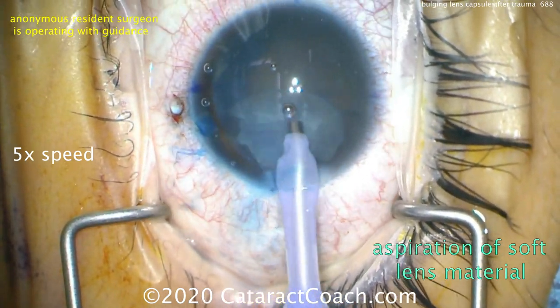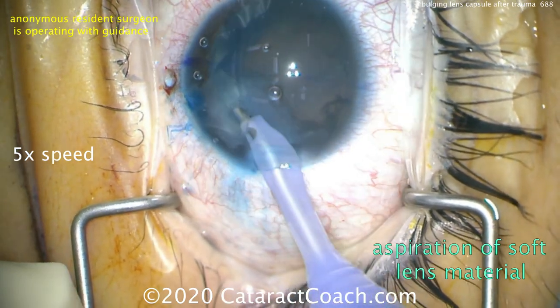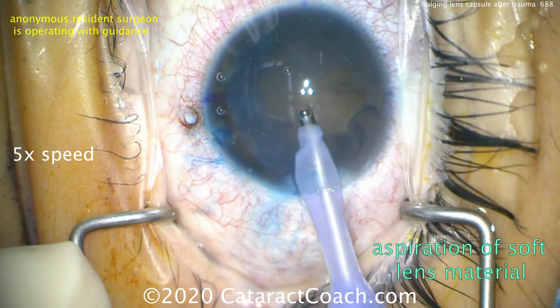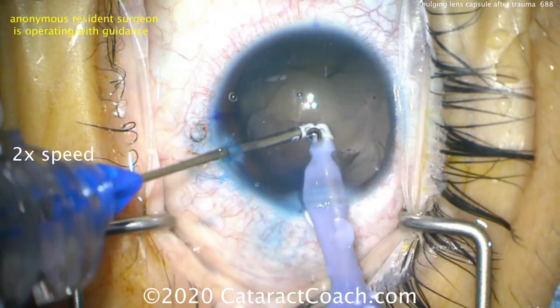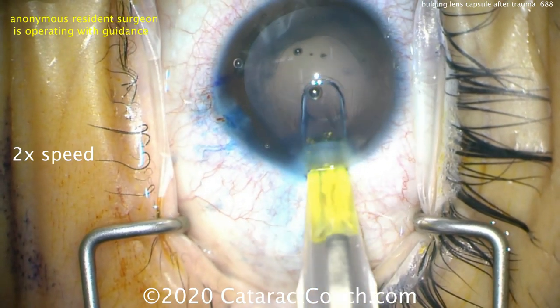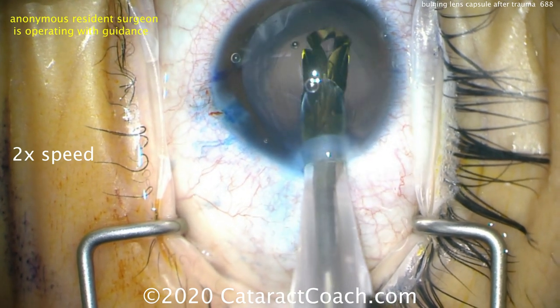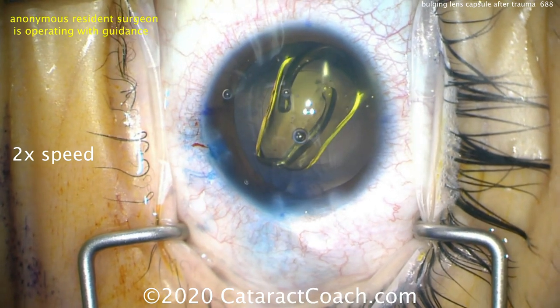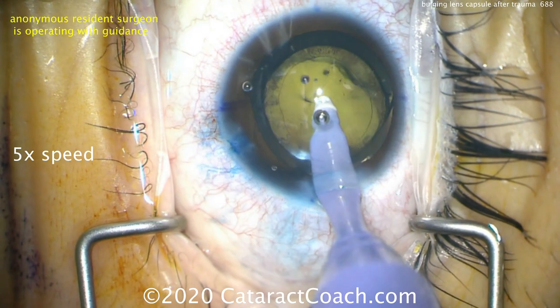The soft lens material is obviously very opaque and it's limiting his vision, and it's going to be removed quite easily. For the lens implant, we're going to choose a toric lens given that the patient has two diopters of pre-existing corneal astigmatism. We're also aiming for a refraction of about minus a half in each eye — distance dominant — with the understanding that the patient will use reading glasses for near work. There goes the IOL going into the capsular bag nicely.